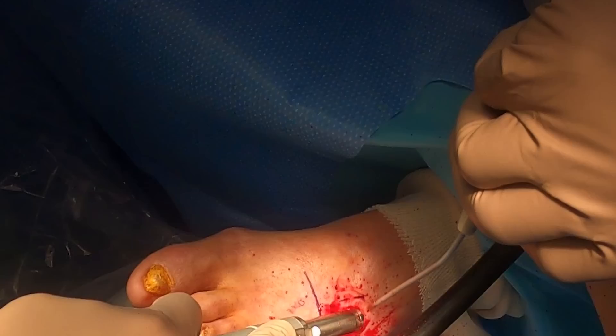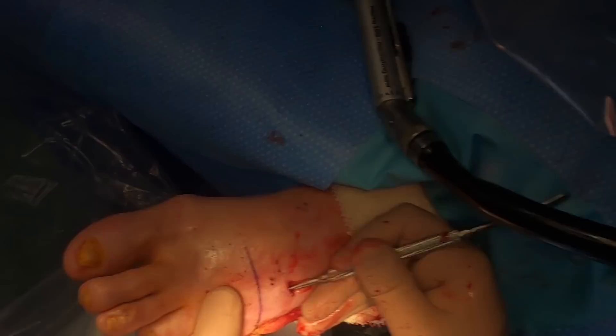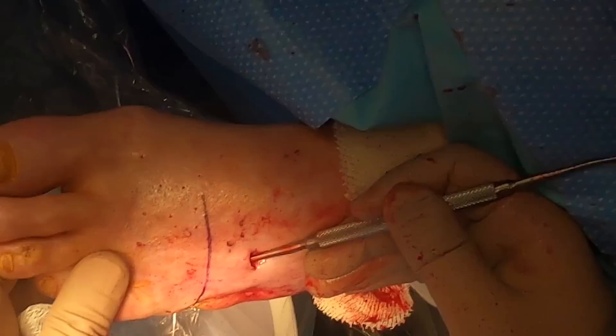Here I am taking the oscillating saw and making a hole in the metatarsal, just about one-fourth from the base. I need to make sure with the freer elevator here that it is a complete through-and-through cut, and I'm also having to remove or free up the bone of its soft tissue attachments.